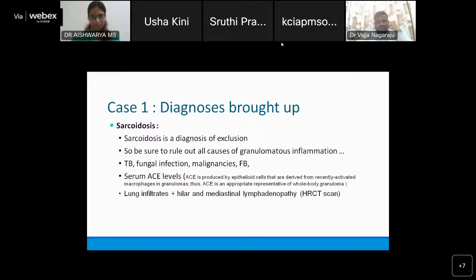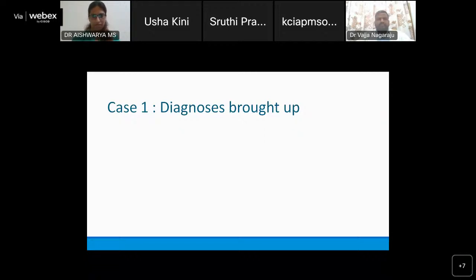And of course, there could be systemic manifestations. Most important is bilateral symmetrical lung infiltrate. So you need to ask whether this patient had an X-ray and whether there is mediastinal lymphadenopathy, hilar lymphadenopathy. All of this is very essential because if axillary can show, I'm sure hilar and mediastinal would definitely be involved if this is sarcoidosis. The others put up are toxo.